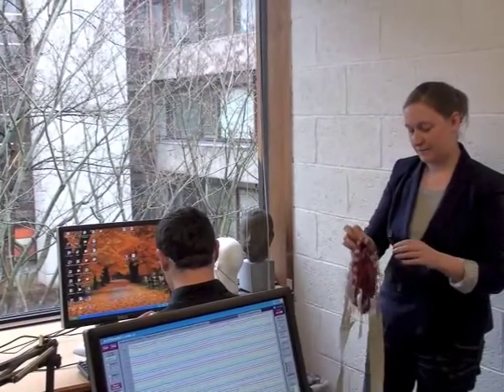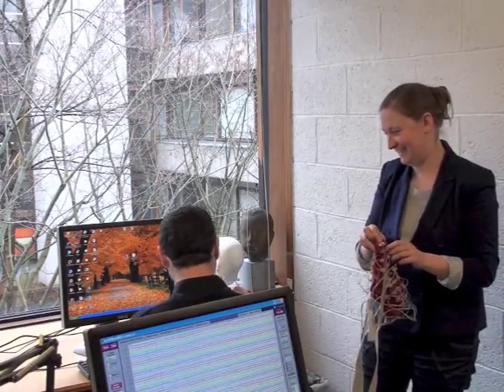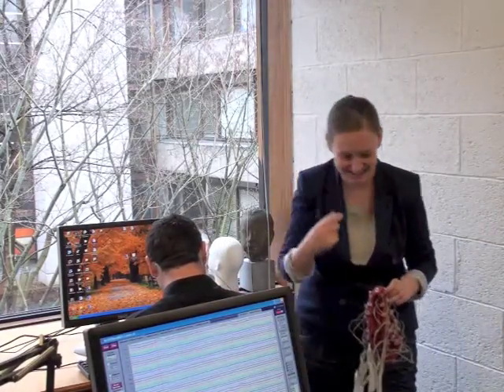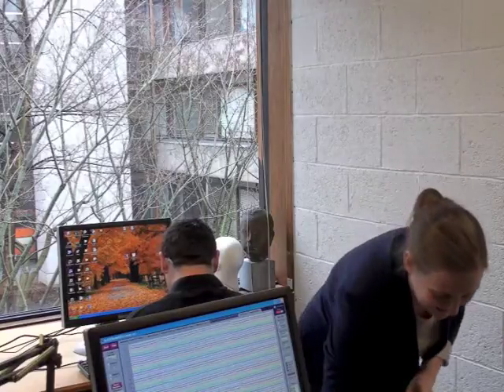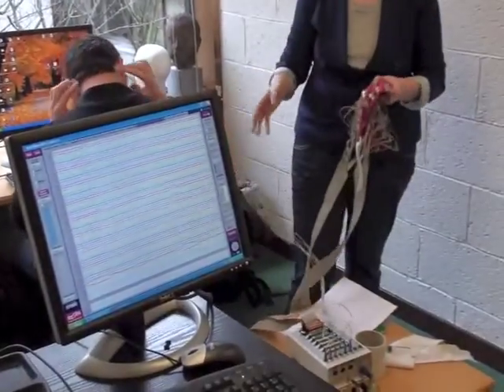So I know that's quite sore. I will be cleaning these. It's pretty gross, half of it's still here. So everything's fine now, you can just turn off the box, that's okay.